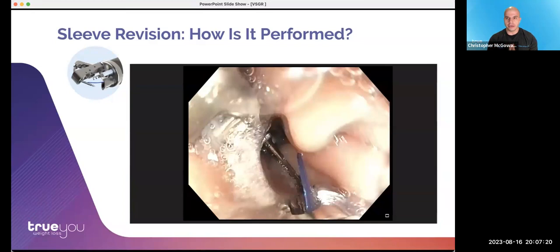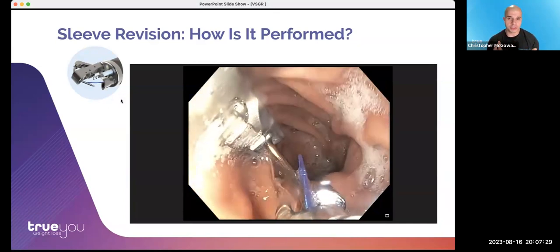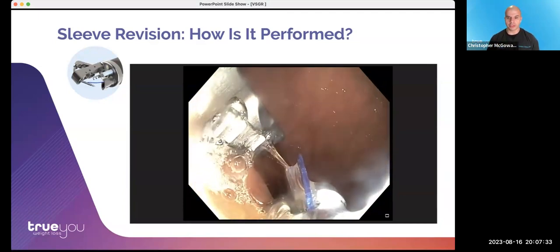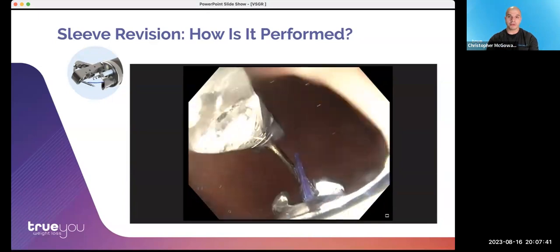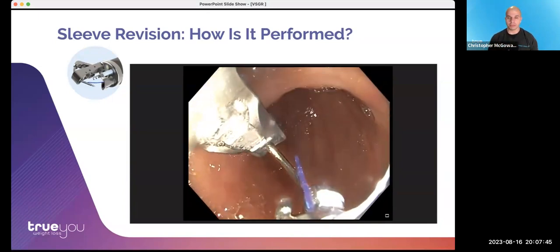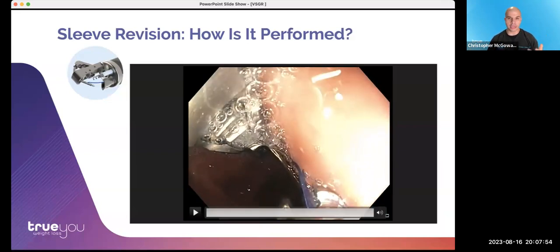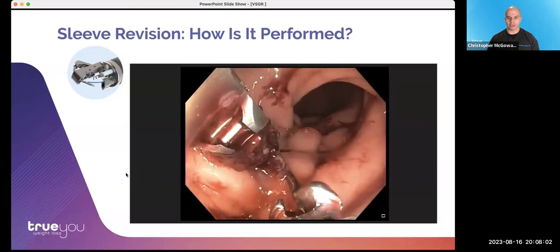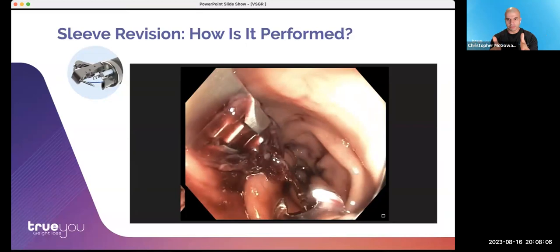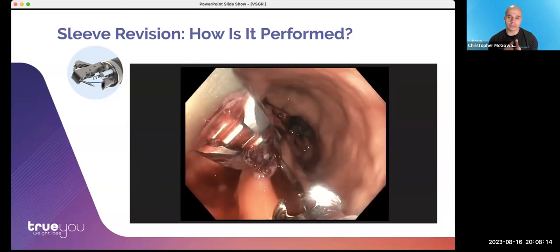Now I want to show actual videos of what this looks like before and after. This patient presented looking for a revision. Going down into the stomach with the endoscope, you can see this is a dilated sleeve — fairly spacious, especially at the bottom — which is why a patient might describe increased capacity and ability to eat larger portions. That's the before. About 30 to 45 minutes later, at the conclusion of the procedure, starting at the bottom and coming upward, you can see the sleeve is narrowed quite significantly — tight against the scope — restoring a very tight, narrow sleeve, allowing the patient to feel fullness with much smaller portions once again.